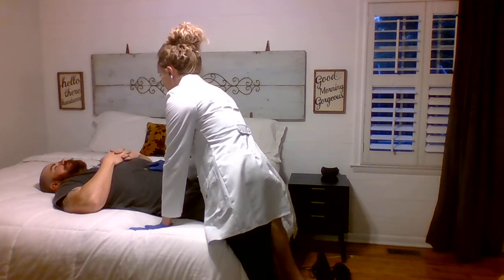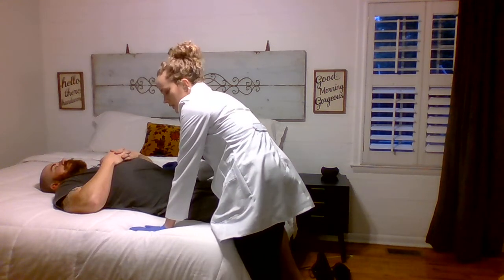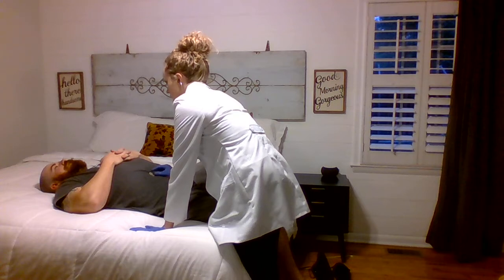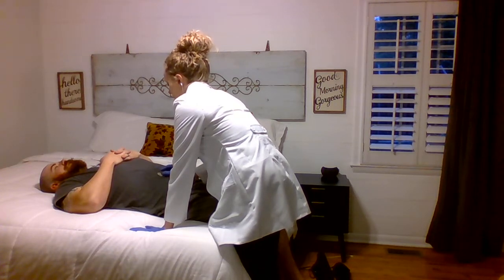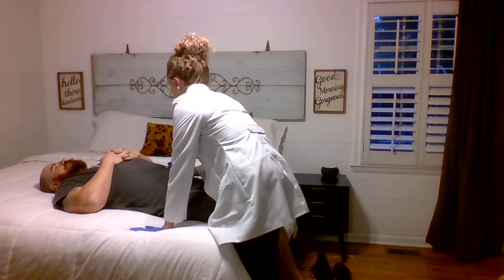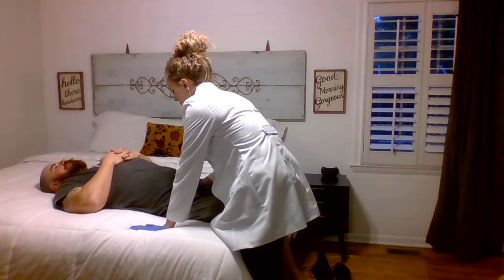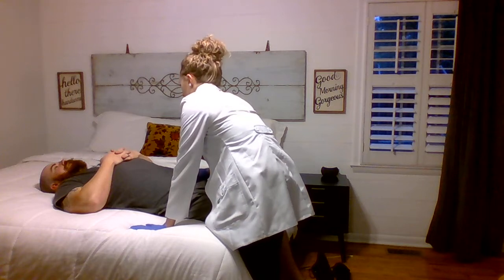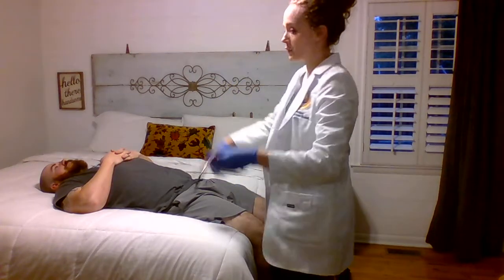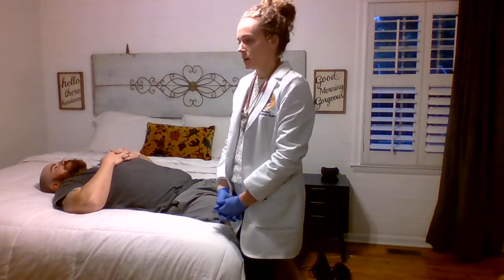Okay, aortic. Renal, so on each side of the umbilicus. Iliac. And femoral. Perfect. No bruits or other abnormalities noted in auscultating those arteries.